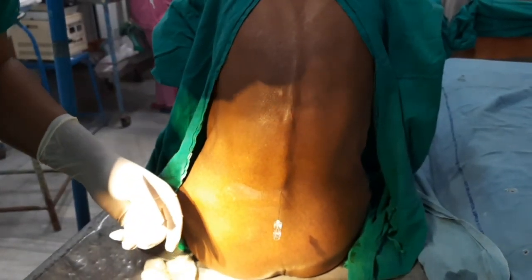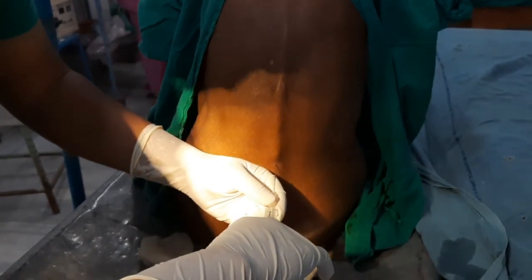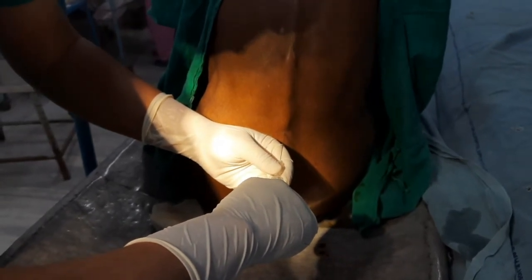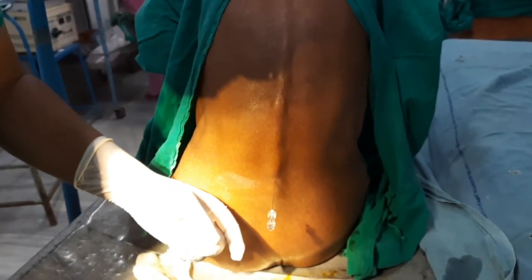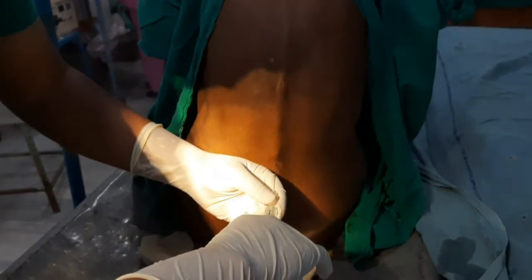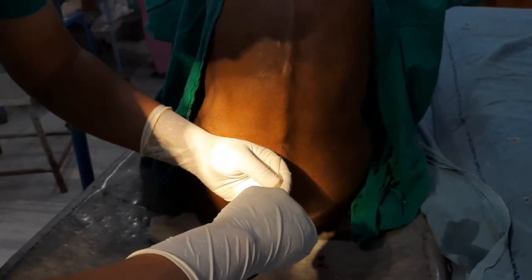Once CSF returns, steady the needle with the dorsum of the non-dominant hand against the patient's back. Attach the syringe with the intended spinal anaesthetic. Gently aspirate some CSF into the syringe. If a hyperbaric technique is being used, a swirling in the solution will be noted due to the dextrose content. Aspiration with an isobaric technique will yield additional CSF fluid into the syringe. The cerebrospinal fluid should be clear. If blood is returned with aspiration, replace the stylet and start over. Inject the local anaesthetic at a rate of 0.2 ml per second. After injection, aspirate 0.2 ml of CSF to confirm that the needle remains in the subarachnoid space. If the patient complains of pain during injection, stop immediately — redirect the needle away from the side of pain and into the midline. Place the patient in the appropriate position for the procedure and baricity of the spinal anaesthetic solution.